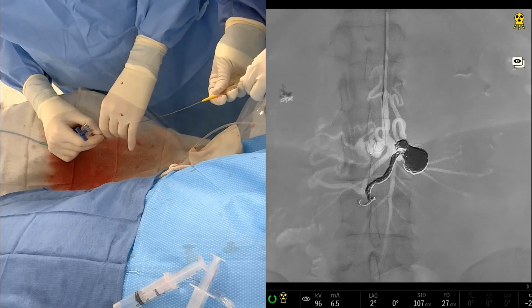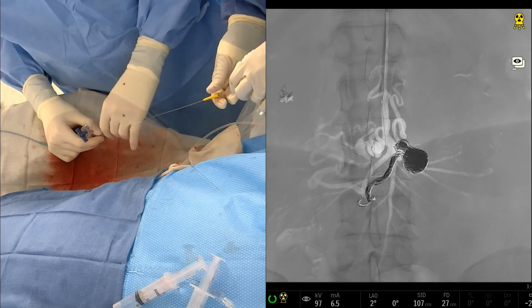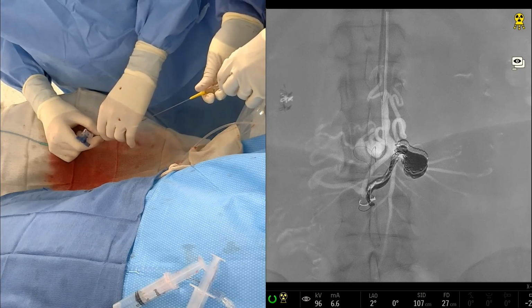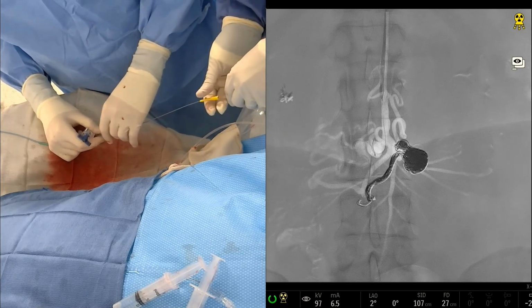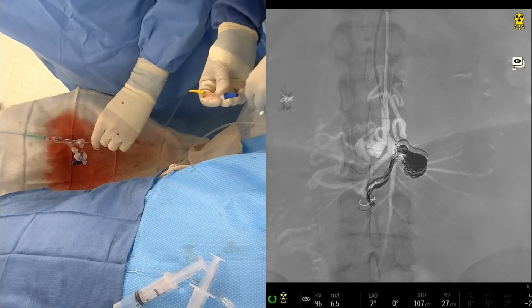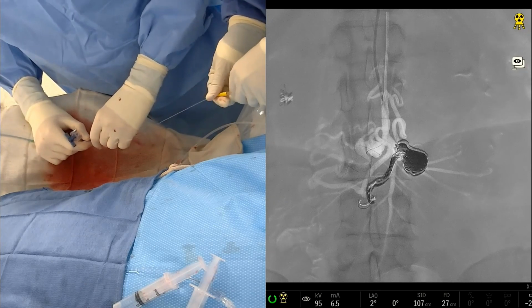Hypothetically, let's just talk about a case like this where you can get into the aneurysm, but you can't get into the outflow. It looks like they're connected. They are connected, the two of them. So you're going to be able to embolize both in the same session, hopefully, which is great. If you were unable to get into the outflow, Rahul or Gary, what would you do?